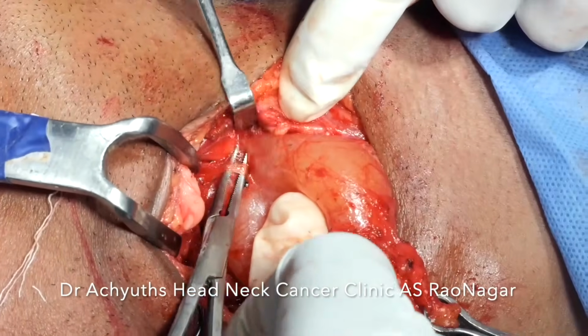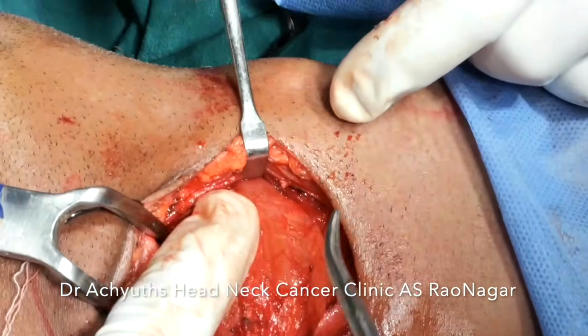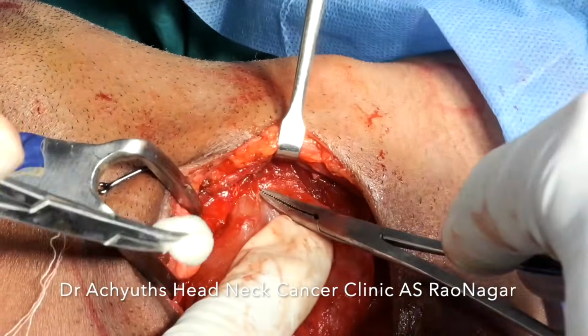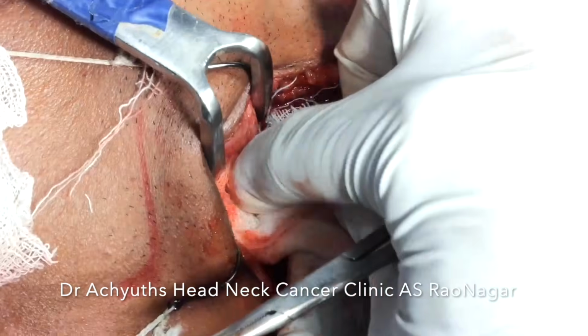And these are the basic instruments which are present in any ENT OT. Now you can see that white line superiorly which is visible is the hyoid bone. We came till the attachment of the hyoid bone now. Yeah, that is the hyoid bone attachment.